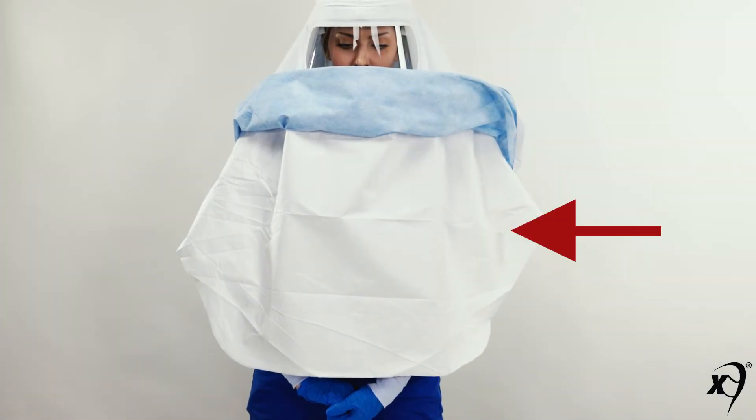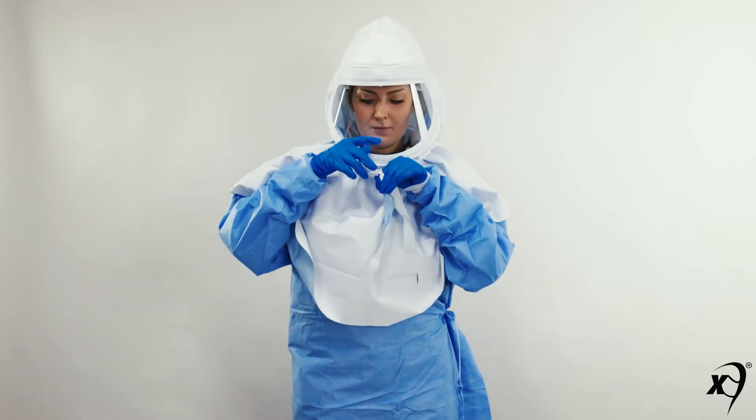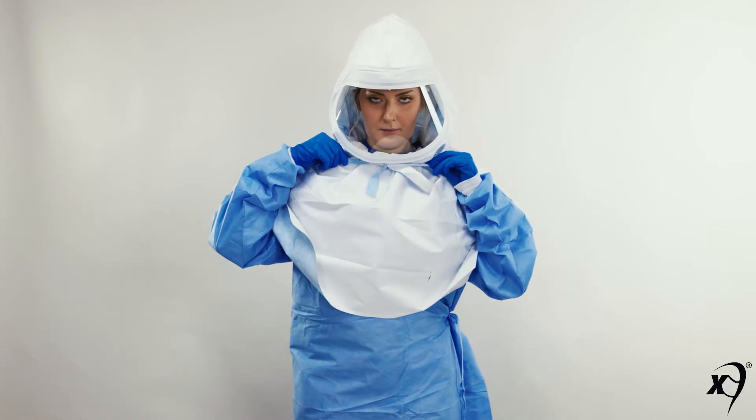Prior to donning a body gown, make sure the inner shroud remains underneath the body gown. Don appropriate body gown. To secure the hood shroud to the body, tie the neck and body ties in the front.